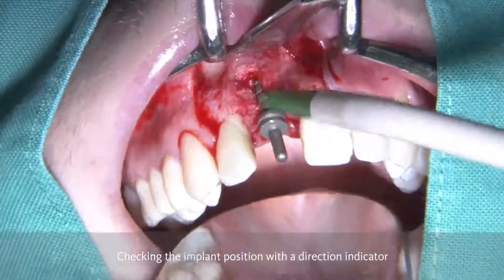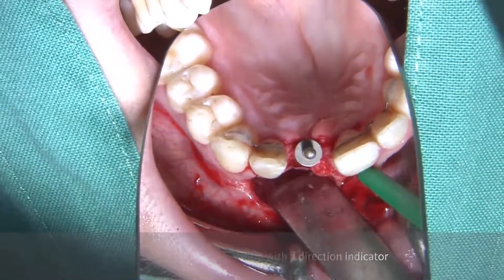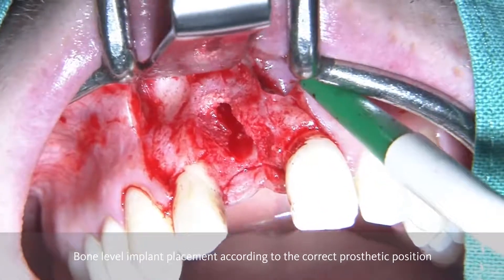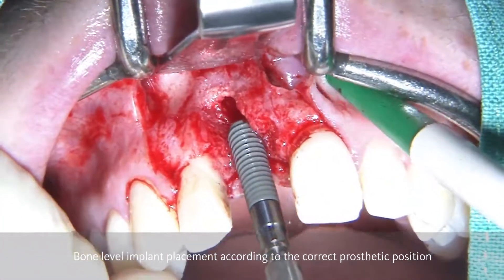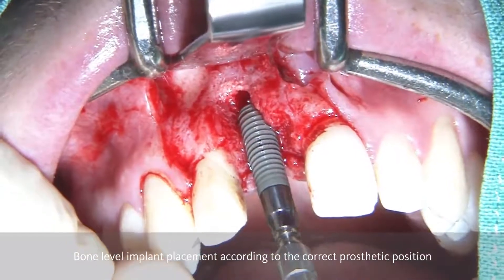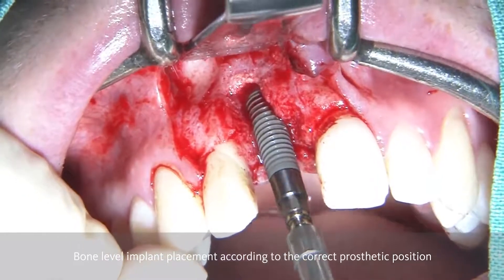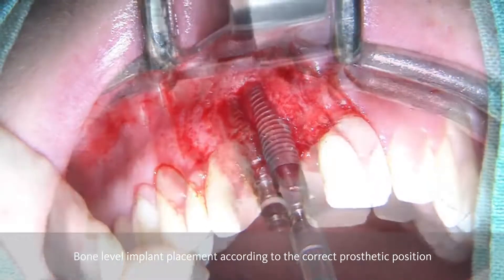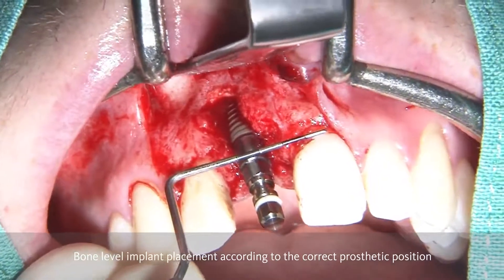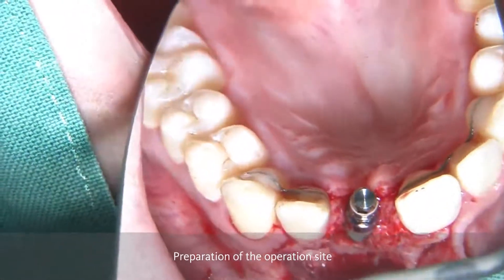The aim is to place an implant in such a position that we stay as far as possible from the buccal aspect, being able to deliver a screw-retained reconstruction. After completing the osteotomy, the implant is going to be inserted according to the correct prosthetic position. After having the implant in place, we check the vertical position — we want to be about 2.5 to 3 mm away from the future crown margin.